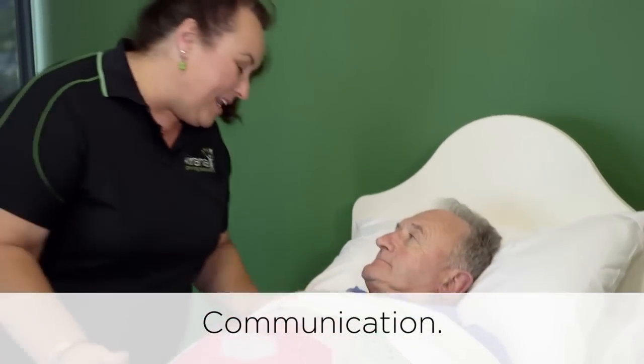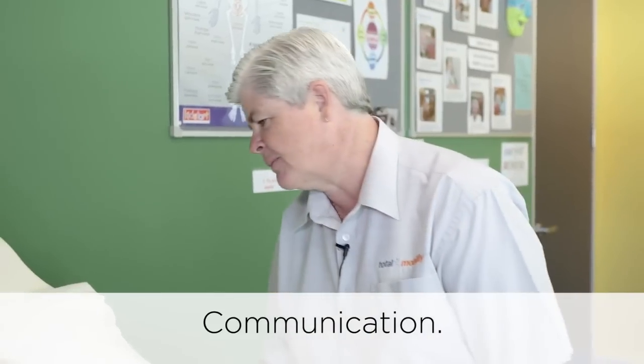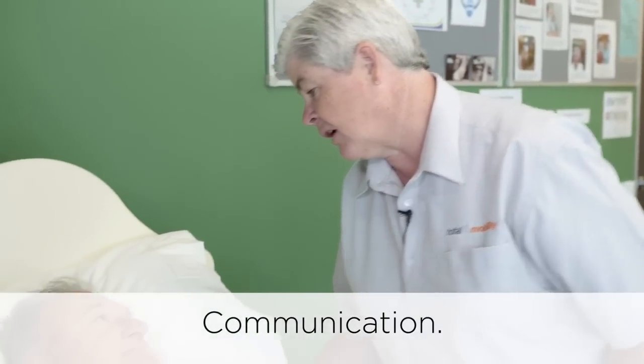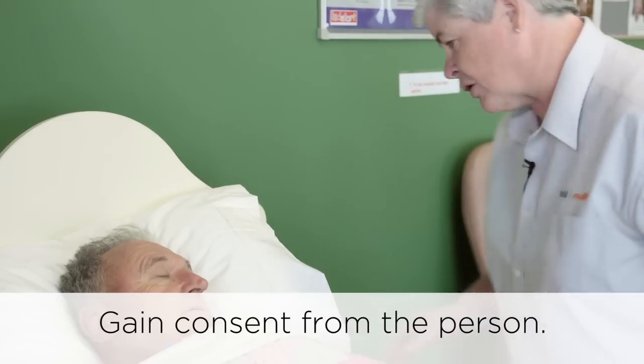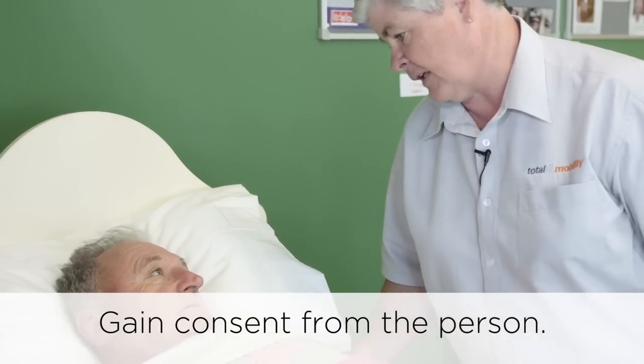Good morning Mr. Williams, my name is Melissa. Good morning Mr. Williams, my name is Angela. Today we're going to use a lifter to get you out of bed and into your chair beside your bed. Are you okay with that? Yes. Excellent.